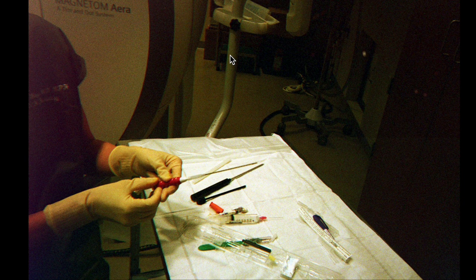When I'm done with lavage, I tell the tech to put it on aspirate, and then I turn the handle of the biopsy device 360 around the cavity. Then I ask the tech to put it on biopsy again, not because I'm going to biopsy, but if you're not lavaging or aspirating, you're in the biopsy mode. So she puts it on biopsy, and then I can take the biopsy device out.